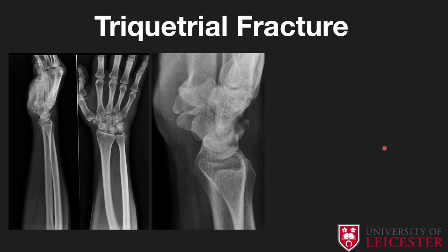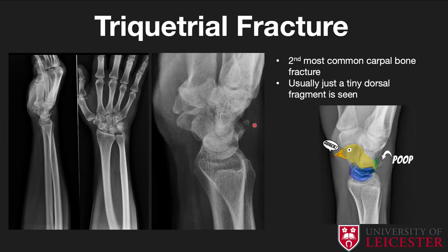The triquetral fracture is unique because it's the only carpal fracture seen primarily on the lateral view. You see a small fracture fragment on the dorsal aspect; on the AP it's difficult to appreciate. The moment you see this, it's pathognomonic for a triquetral fracture. It's the second most common carpal fracture after the scaphoid. A useful sign is the pooping duck sign: the lunate is the nest, the scaphoid is the bird, and the fracture fragment is the poop.